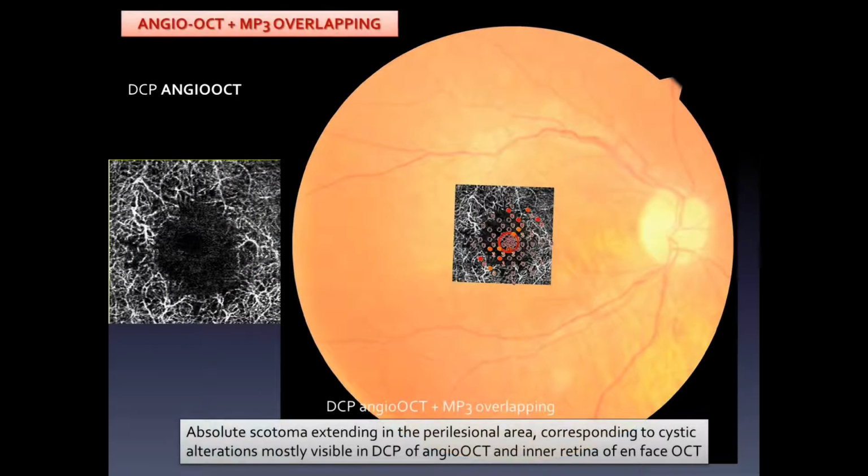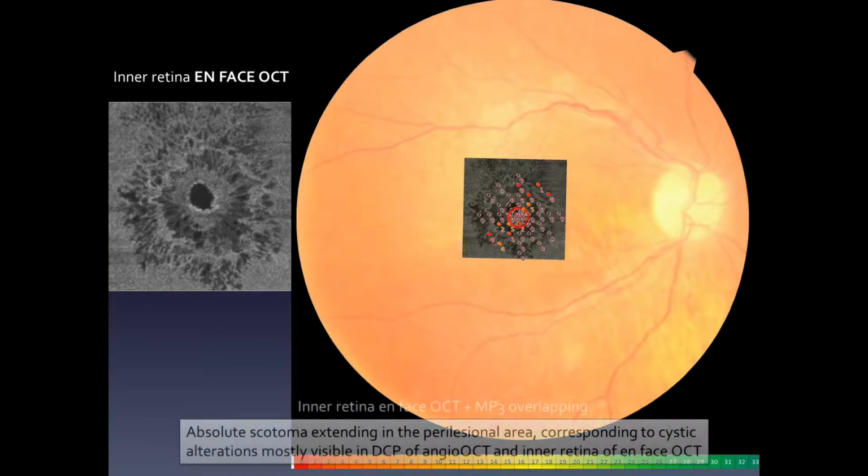This you see in another case. You see the deep layer of AngioOCT. This is the microperimetry. You see the scotoma extends very, very far from the area of the absence of the neuroretinal tissue. The scotoma extends up to the area of the microcystic space in the internal nuclear layer. This is another case.